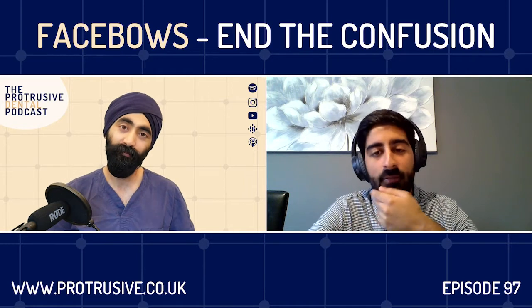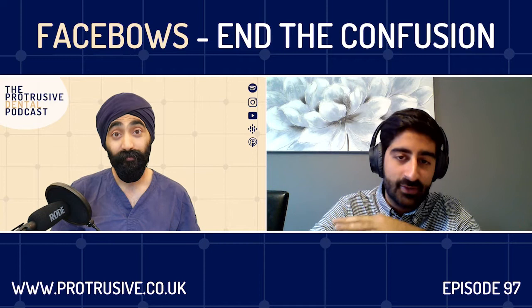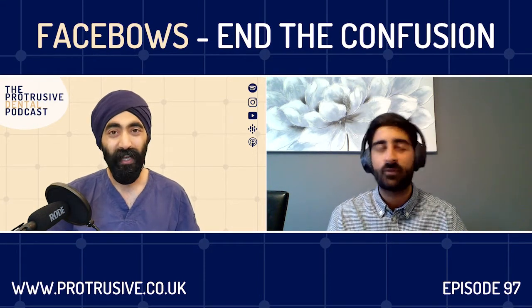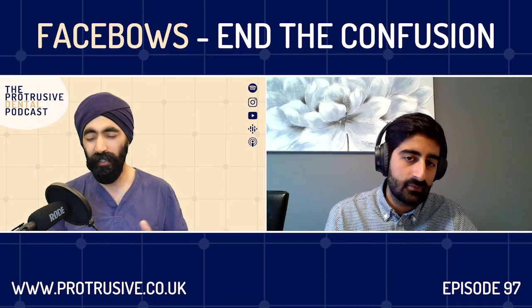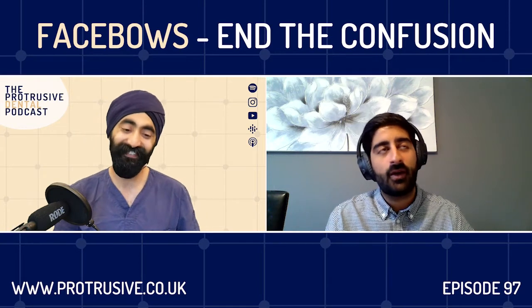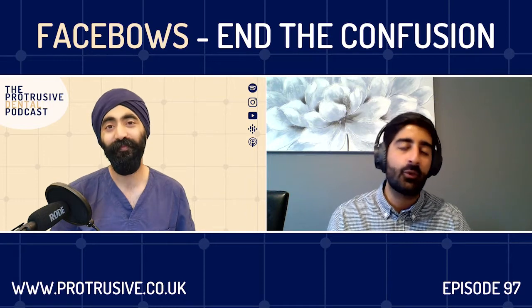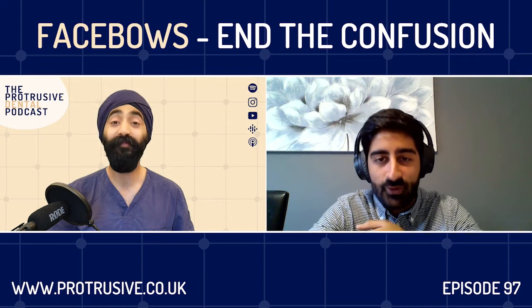There are two really interesting papers that I read this year. There's one by Carlsson, I don't know if you've heard of his papers, like Dogmas in Dentistry. You'd really enjoy it. He goes through all these. It also talks about why centric relation isn't this magical point. Is it the same paper we're talking about? Yeah. He also talks about why primary and secondary impressions are not required for dentures. What's the simplest way you can make a denture? Does this actually change your clinical outcome at your final restoration?